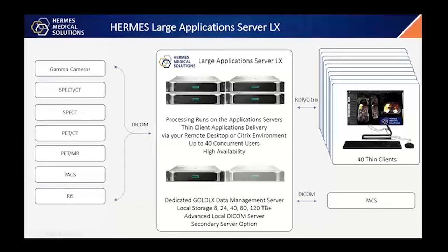When we provide hardware, then obviously we can provide the right specification, or we could provide the specifications for your IT so they can buy their own boxes that are the same, but we can't virtualize on any old servers that you have in the department. So that may be a little bit restrictive sometimes. So you may want to have this offsite, so you don't have any of the hassle of having this within your own IT infrastructure.